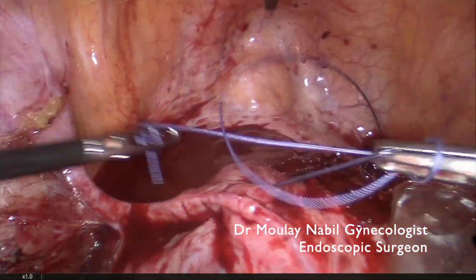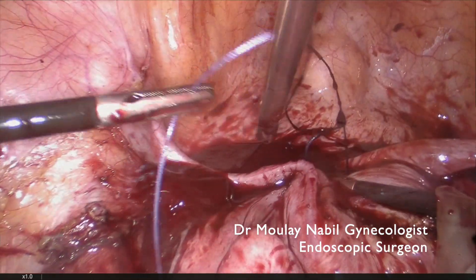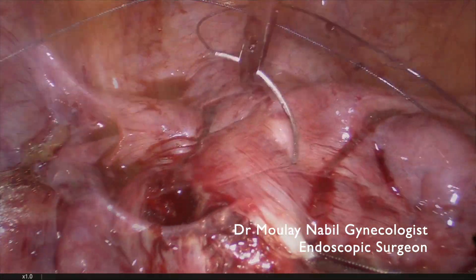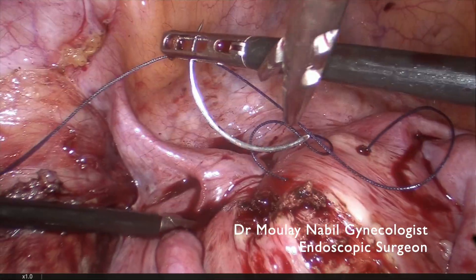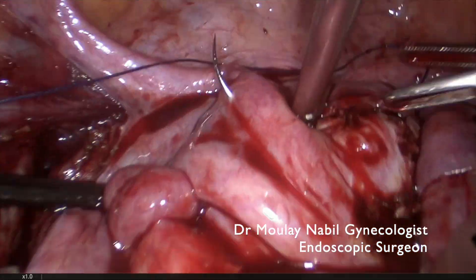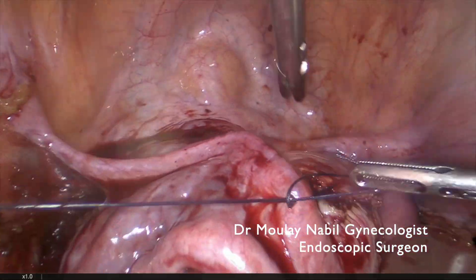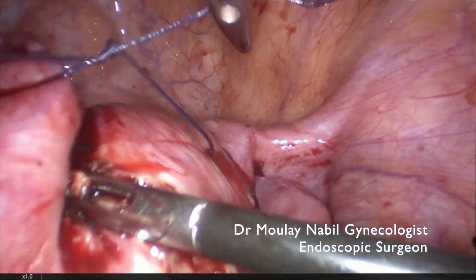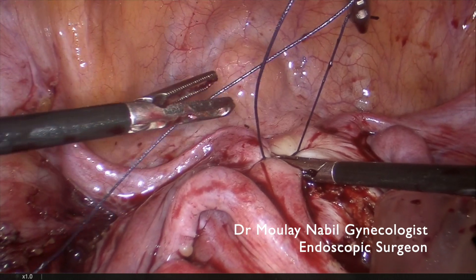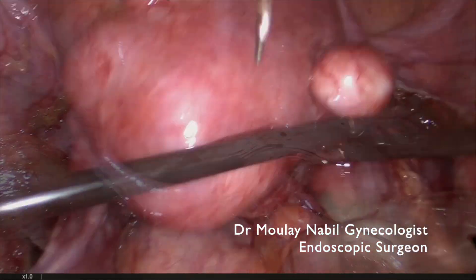Using the same technique: a double flat knot, invagination of the tissue inside the myoma bed, then locking the knot in the same way the previous loop was done. The first stitch alone allows us to control more than 90% of the hemostasis. It is important not to include the proximal part of the tumor within the stitch. We can also use a suture around the bed for hemostasis, and we tie until the tissue turns white, confirming a well-tied knot.